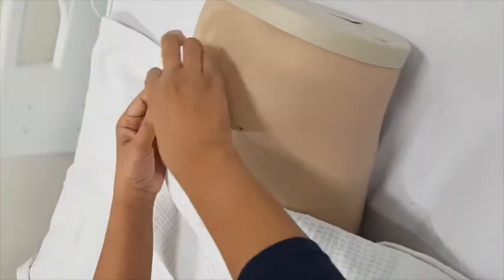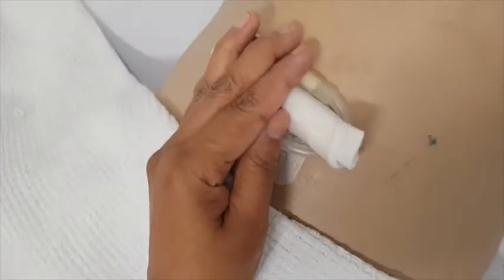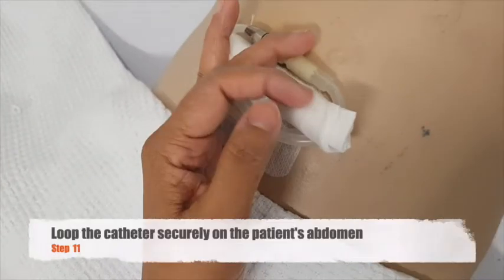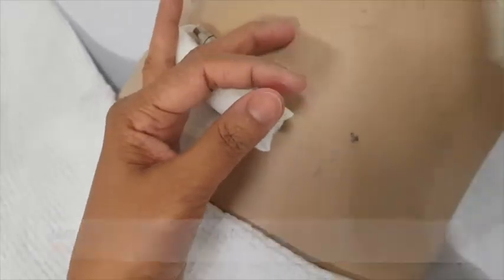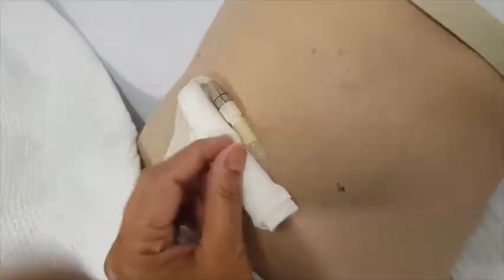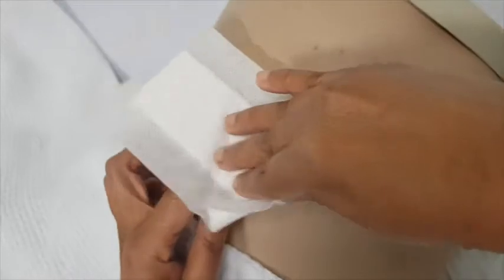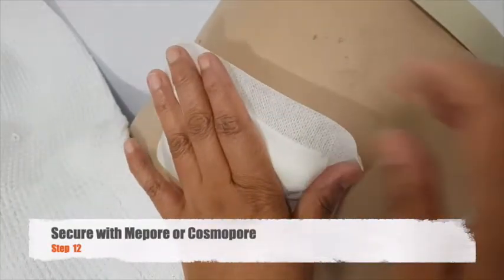Secure the patient's catheter by making a loop and placing it securely against the patient's abdomen. Then, take your Mepore or your Cosmopore dressing and apply it securely on top of your patient's catheter.